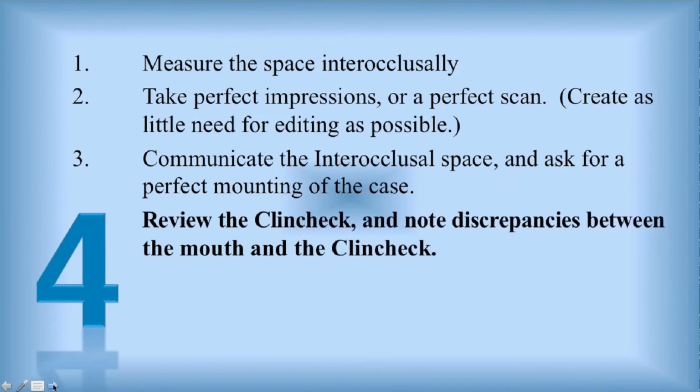So once you get the ClinCheck back, you have to notice the discrepancies between the mouth and the ClinCheck. You have to look at that very carefully in a way that you're not used to looking at. That is, how much space is there between them. And the grid is very helpful for that. You can adjust the teeth in the grid so you can look between the teeth and get a guesstimate of how close they are. And are those posterior teeth open the way they are in the mouth?